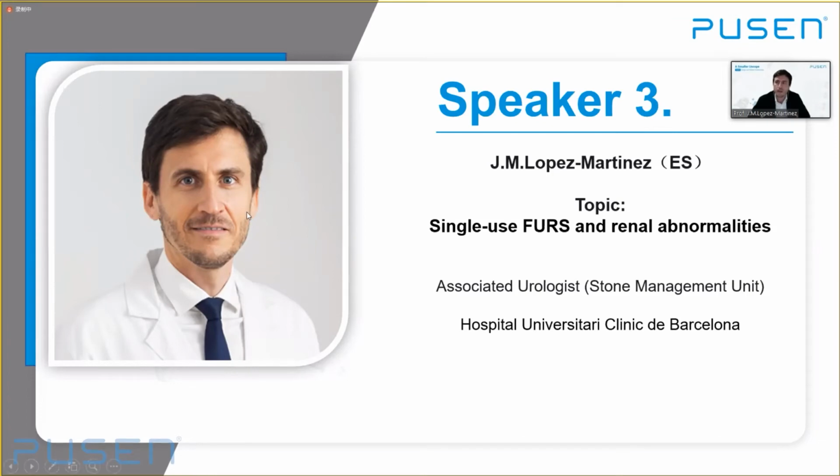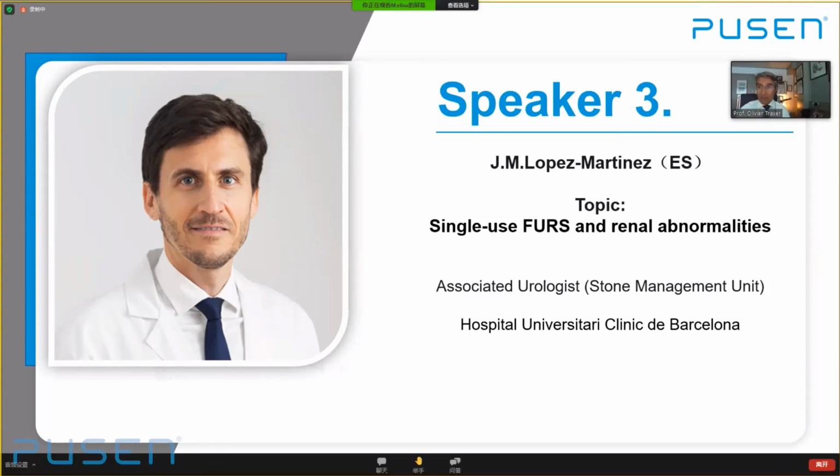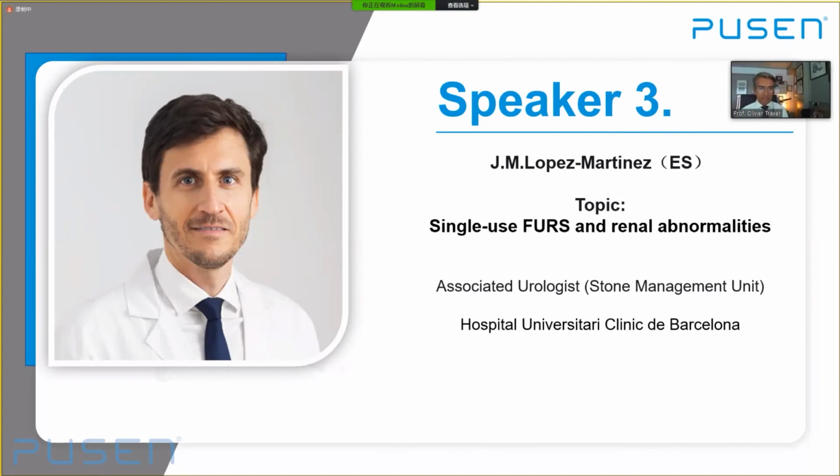Because with this new scope, we have the possibility to have a digital vision, a digital camera with a small diameter, which is really interesting for upper urothelial carcinoma. I fully agree with you. I think now we can take the benefit of small size, digital view, and single use in case of any breakage. Thank you so much for your excellent presentation.